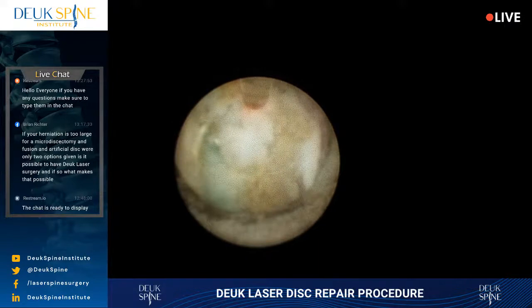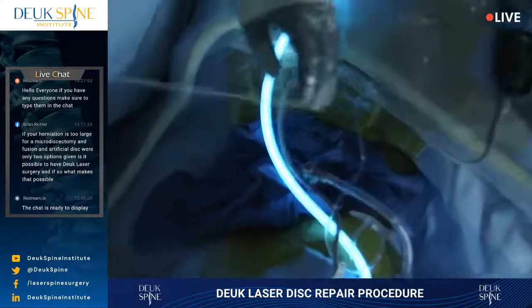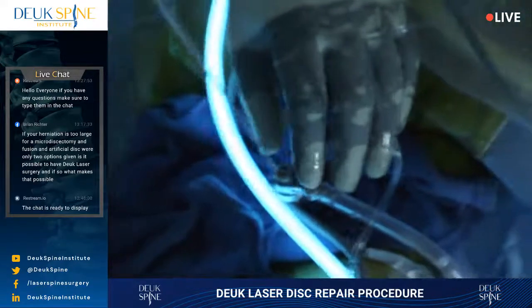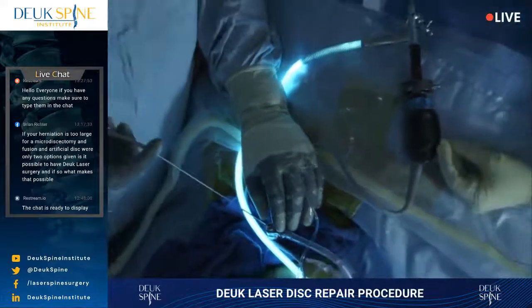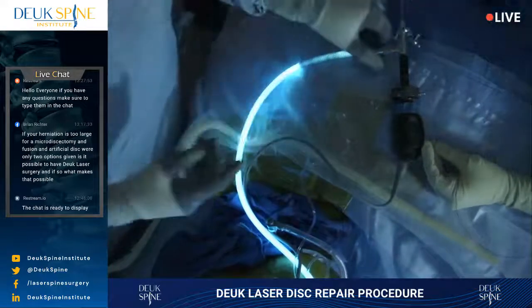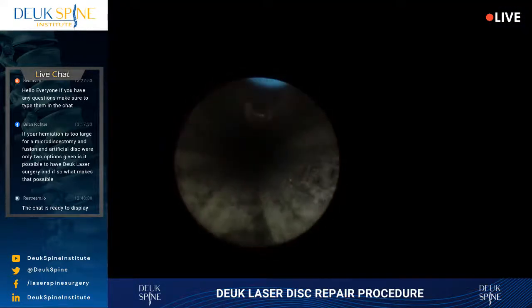I'm going to try to grab it out, okay? Because it'd be safer for me to do that if I can grab it out than try to use the laser right now. If I can just get a piece of it, it's like a piece of wet cotton stuck down there pushing on the nerve. And I don't think I got it. Try again. I don't think I got it, but let me go look. I don't think I was able to get it. So I may have to just laser it out.